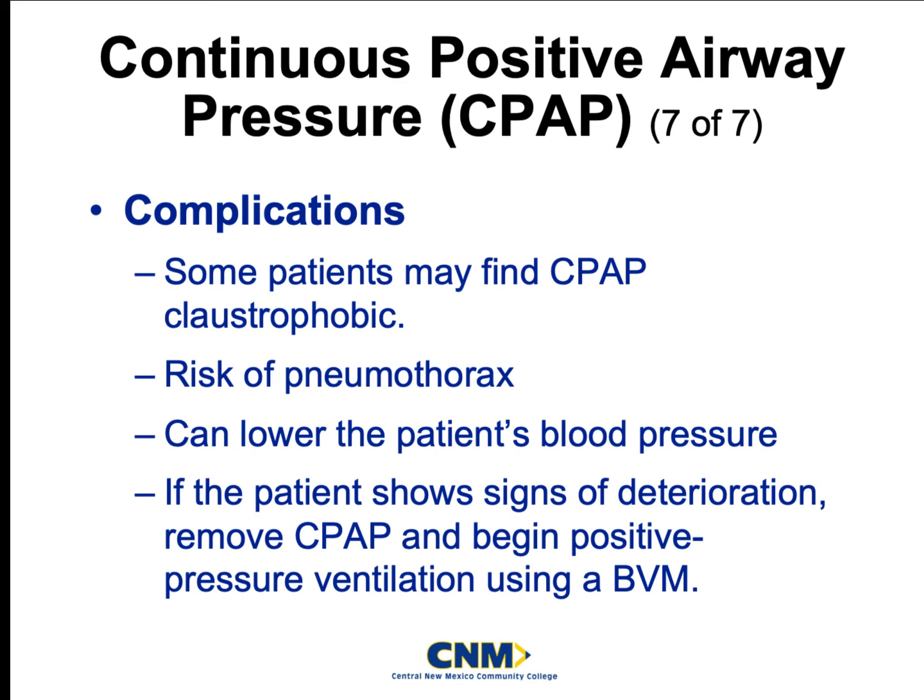And I think the best way to do this is to get the patient involved as much as possible. When you guys are holding that mask to the face, have the patient do it themselves while you are setting up that headset to strap it down to their face. Turn the machine on while you are doing this. Okay, crank that machine on, turn it up to start at 5 of PEEP, and have the patient hold it forcefully against their own face and start breathing while you are setting up the actual headset for it. It's amazing how putting somebody in charge of their own treatment can be beneficial.